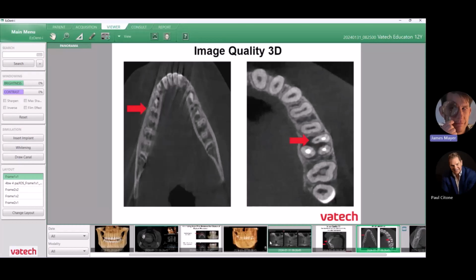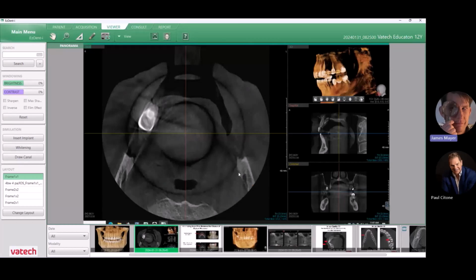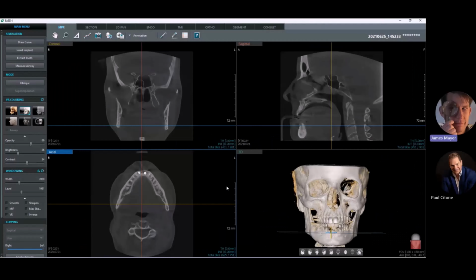Also wanted to touch on something else you may see in the cone beams, and this shouldn't be there. If you do see any circles within the data, here we have one circle, two circles within the axial cut, and some long, dark vertical lines on the other. This is where the device needs a beam alignment or some internal adjustments. So if by chance you do see that, that is something we would need to have our service team log in and adjust. So Paul, we just finished up looking at patient movement.